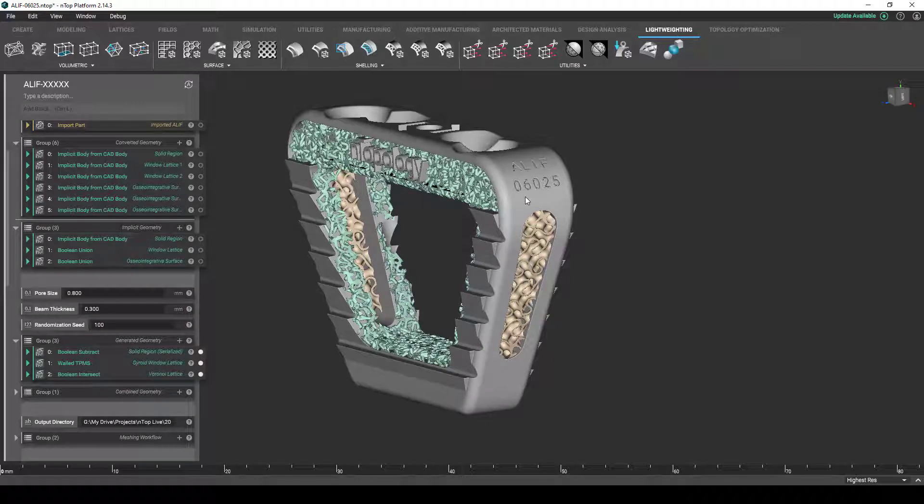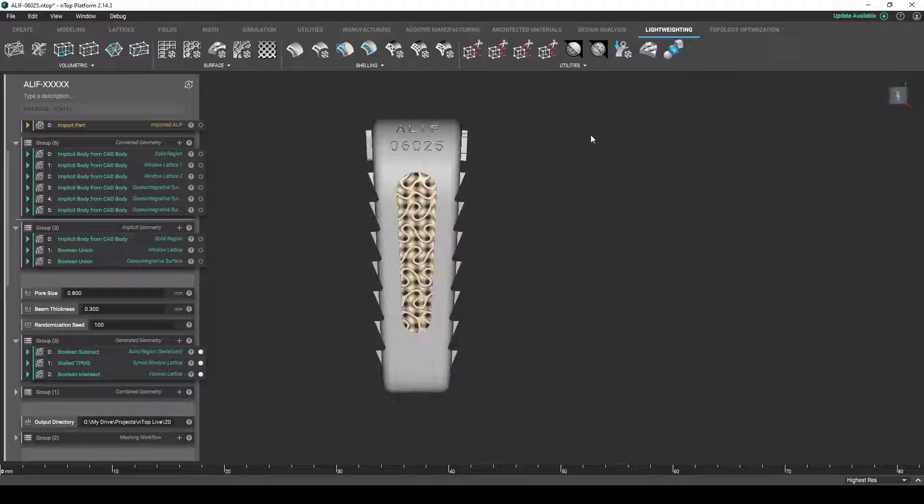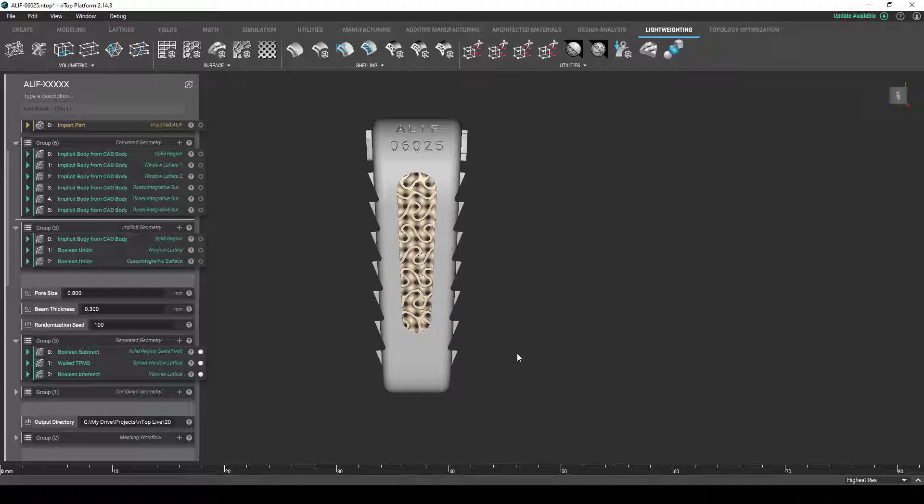In this case, we can see that we've applied ALIF 06025. For this part family in particular, the first two numbers, 0 and 6, describe the base width of the nose of the ALIF in millimeters, so 6 millimeters wide for this part. The last three numbers describes the angle of the ALIF in tenths of a degree, so the 025 indicates that the angle of this configuration is 2.5 degrees. It's definitely more on the subtle side, so it's a bit hard to see this taper, but it is there.